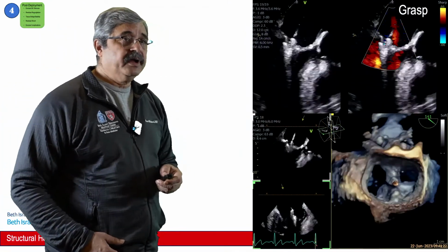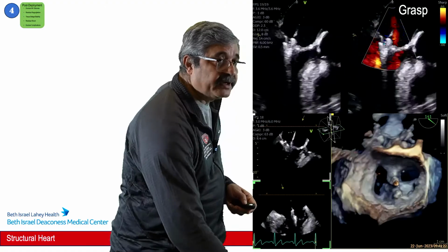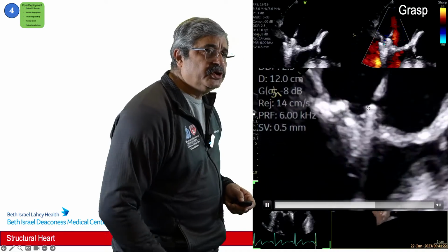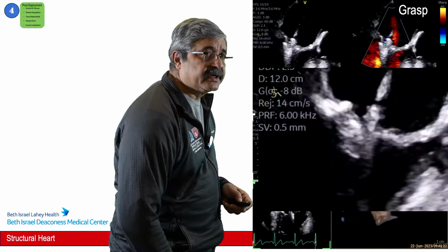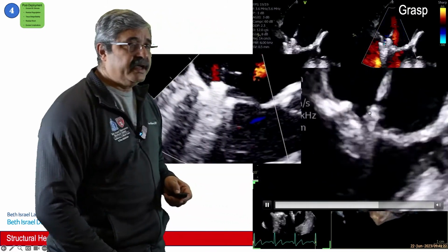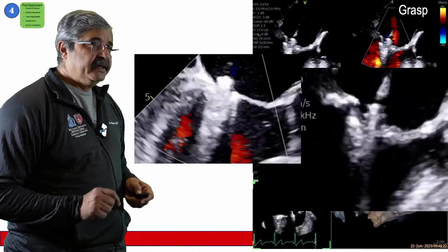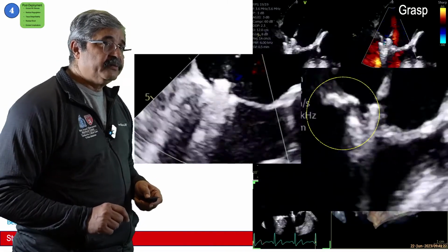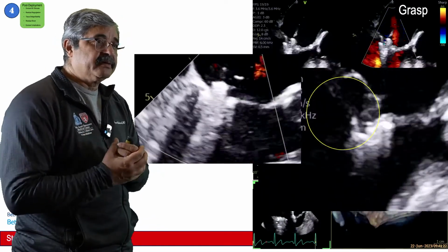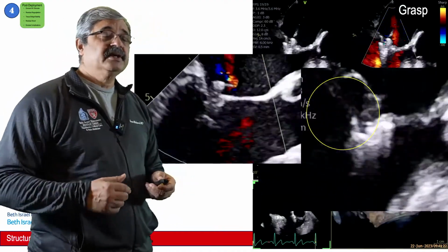As you can see in this specific one, a clip has been applied, there's significant reduction in mitral regurgitation. However, if you take a look at it, there's a lot of motion of the posterior leaflet right where it enters the clip. This is exactly somewhere around here. You can see there's a lot of motion. Now contrast that to this clip here, which shows a very strong grasp, and there's essentially zero motion. Now the one before, which shows a lot of motion, means that the leaflet is not completely being grasped in between the grippers and the arms, and there's possibility that if the tension keeps coming up, we're going to have a single leaflet detachment. So that's called the grasp of the leaflet.